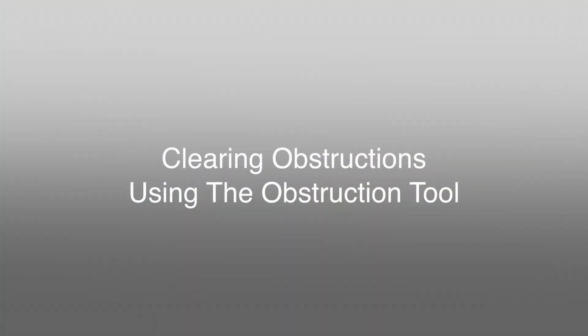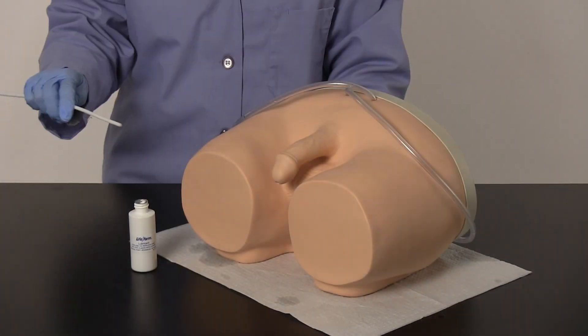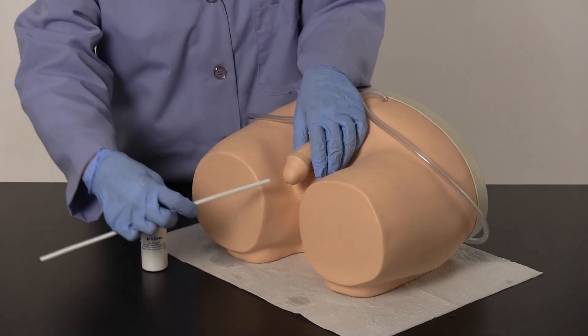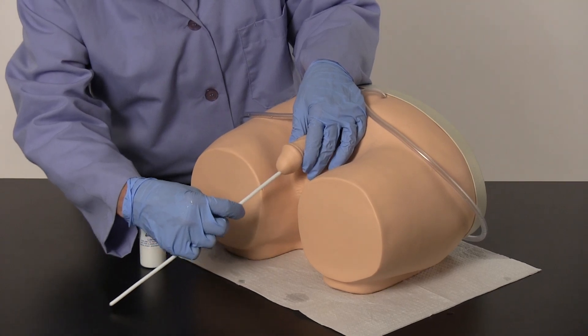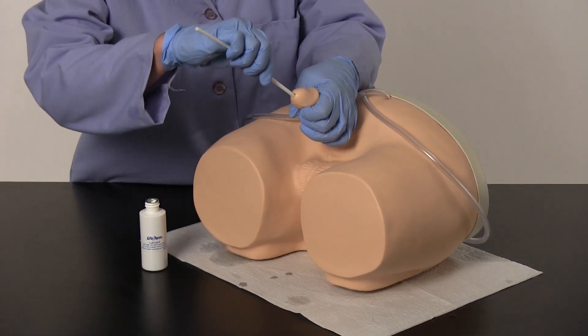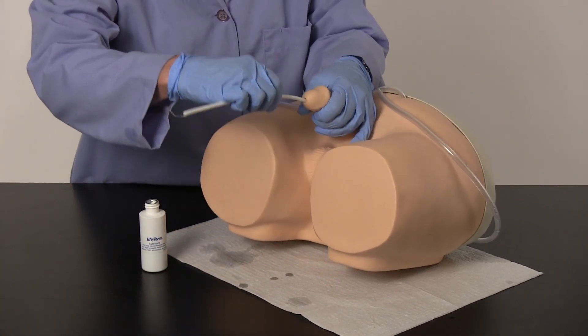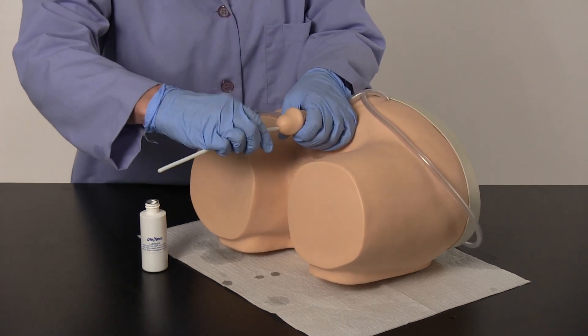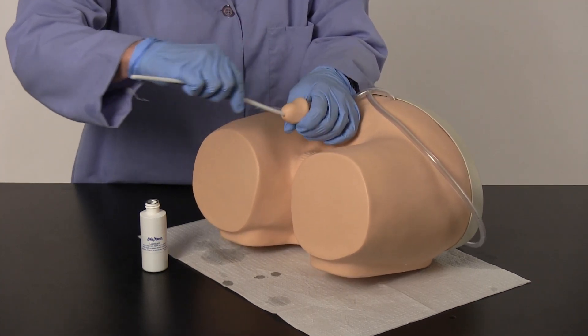Clearing obstructions using the obstruction tool. Generously lubricate the obstruction tool and insert it into the urethra following the same catheterization procedures. Remove and reapply lubricant as needed until the obstruction tool is able to enter the bladder. Follow this procedure by flushing the system with warm water to clear the built-up lubricant.